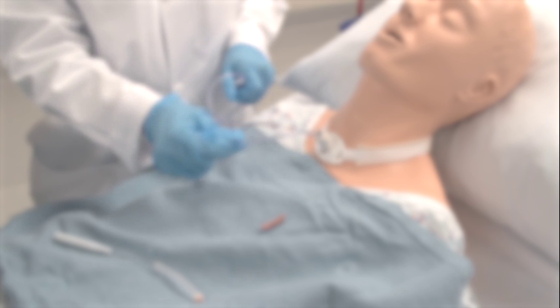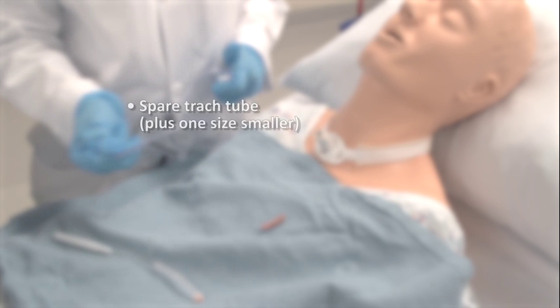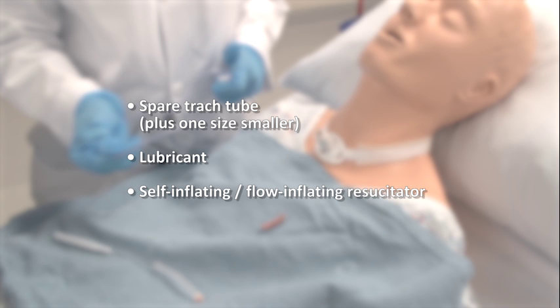Ensure that the following equipment is at the patient's bedside: a spare trach tube of matching size and type. Consider having a trach tube that is one size smaller available for an emergency if needed. Lubricant, self-inflating or flow-inflating resuscitator.